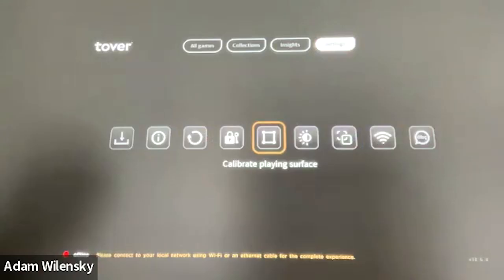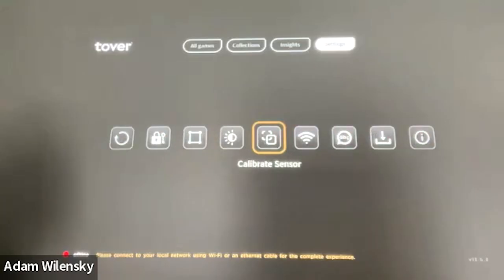We have talked briefly about the setup and calibration, and I want to talk about troubleshooting for a minute. So let's say that your unit doesn't have sound, or let's say that it's unable to update. Well, a reset is important. But if you continue to have challenges in that respect, please reach out to us. We're happy to provide direct assistance. For the most part, the software updates should resolve the issue.